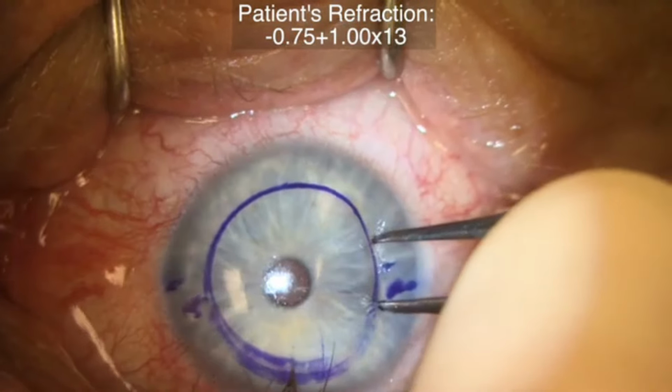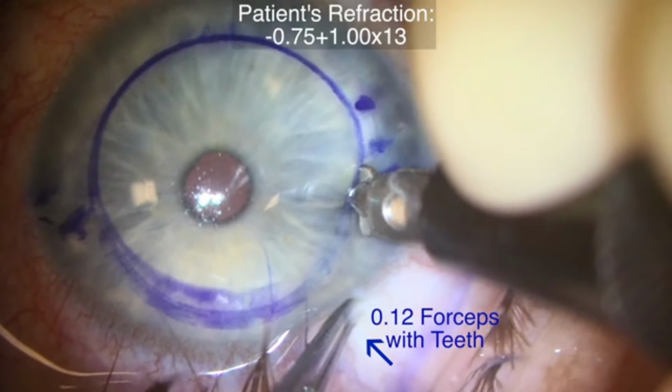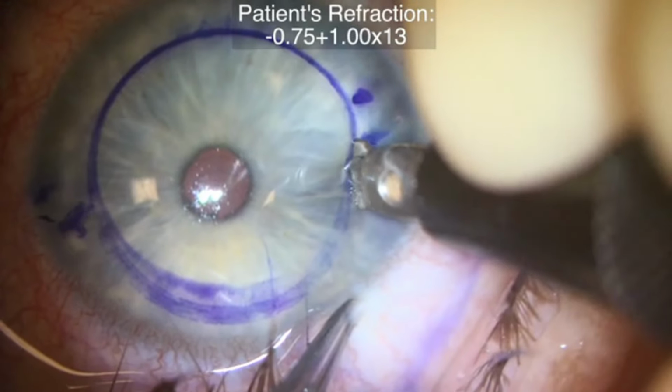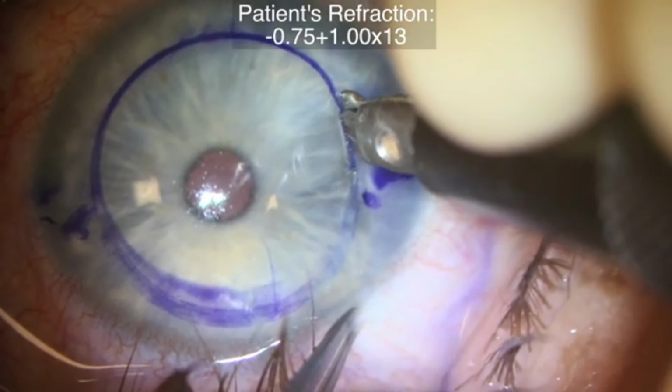A few surgical pearls. Stabilize the eye with 0.12 forceps with teeth to provide countertraction and prevent torque of the eye from the diamond blade. We either move the diamond away or toward the 0.12 forceps with teeth. Also, stabilize the hand with the 600 micron guarded diamond on the patient's face or cheek so that the diamond will move in sync with the patient if the patient moves suddenly.